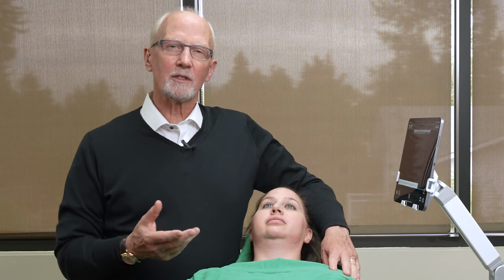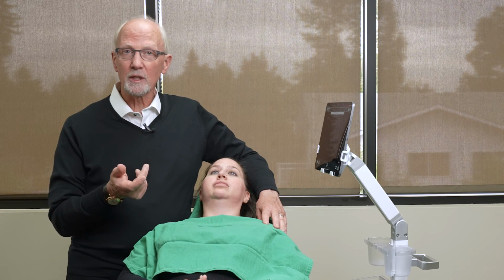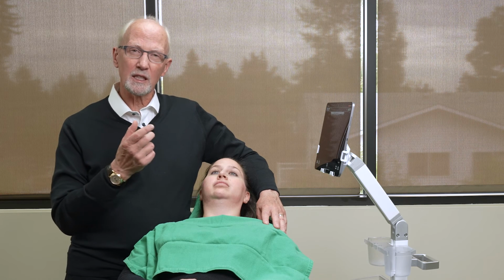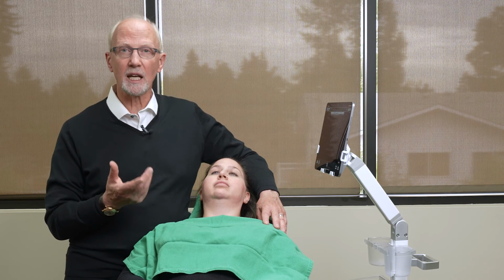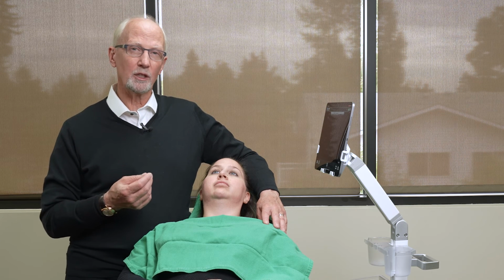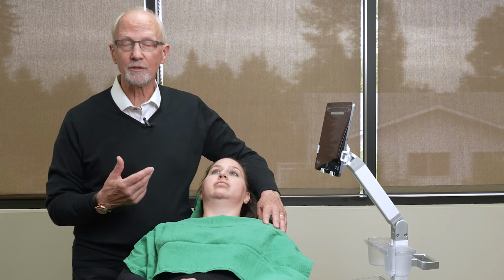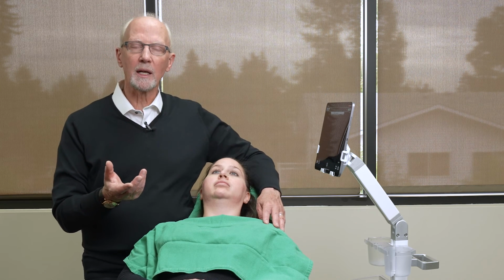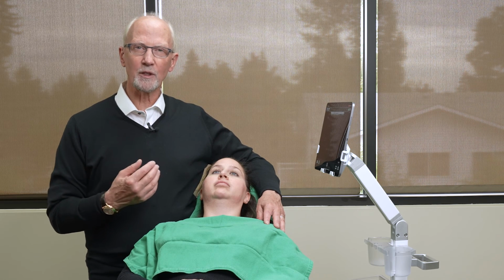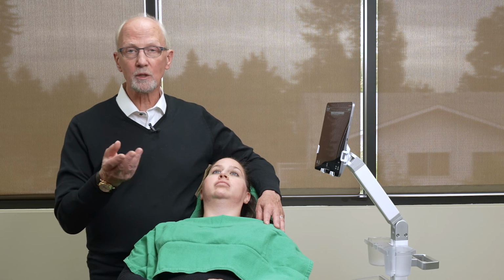Excellent. During our session today, you've seen us use ultrasound to examine filler coming out of the cannula, to see its placement within the tissue as it's coming out. You've seen it with and without the color mode on to show that we are not inside a vessel. You can see it during active treatment, much like you would be doing in your clinic.